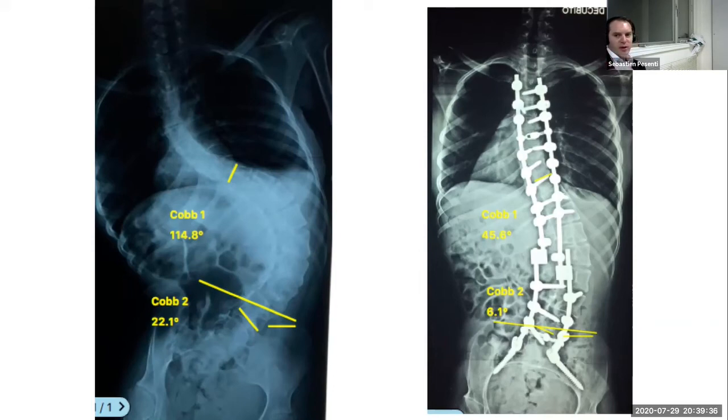You can gradually tension your bands, or maybe that's what you did, in order to progressively pull the spine towards the rods, and then help you put your rods into the screws. Did you do this, or did you just tension the bands at the end in order to protect the apex? No, actually, we tensioned the bands at the end, after the correction.